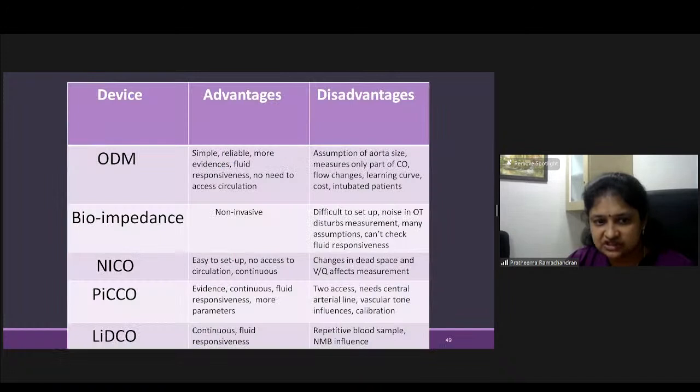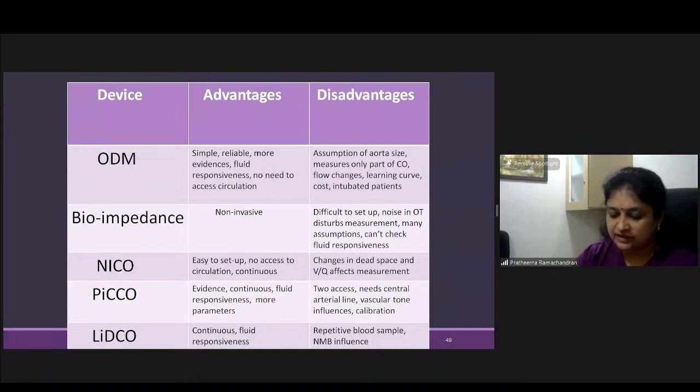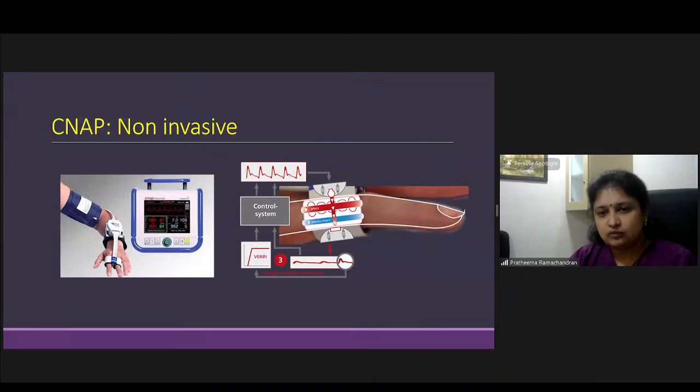So it is very difficult to set up, and every small noise causes an issue, and it is not foolproof. So that's why I just mentioned it. We need to know what it is, but it is non-invasive, yes, but it is not very, very trustworthy as of now. And this is one of the latest things which we might see in our OT soon.